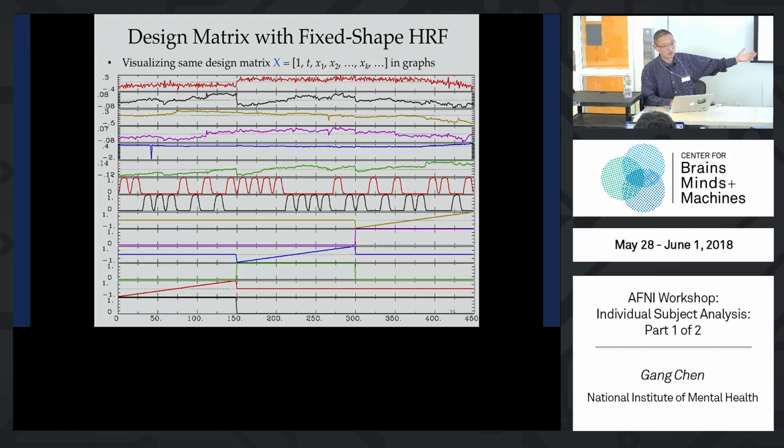That's just empirical data. Ideally, not just the slow drift, even the tasks or head motion parameters. As a statistician, very unfortunately in FMRI, people have a model, run it, then just talk about the result. As a statistician, usually it's not a one-time deal. You need to go through multiple rounds of model building and model checking.